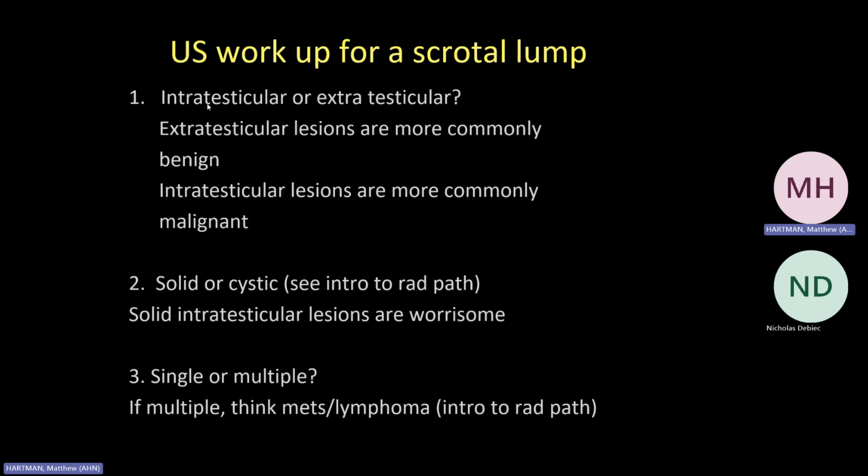So a typical scenario is a patient comes in with a scrotal lump, and we are going to use ultrasound. A couple of questions we want to ask ourselves. Number one, is there a lesion? If there is, is it intratesticular or extratesticular?